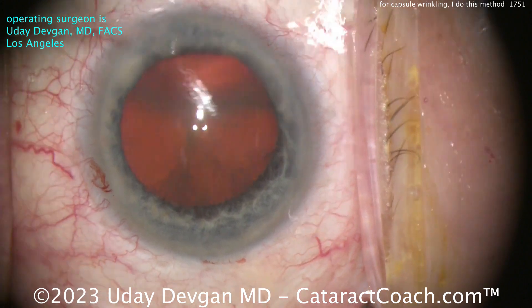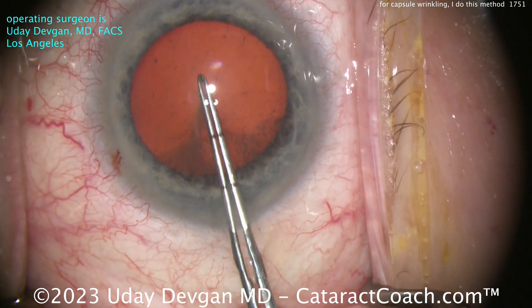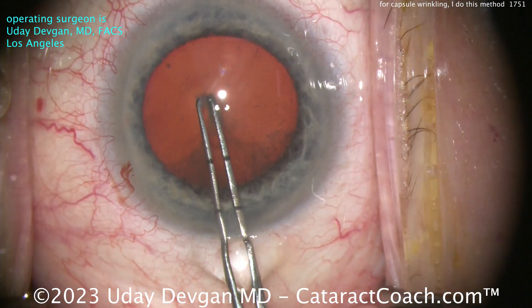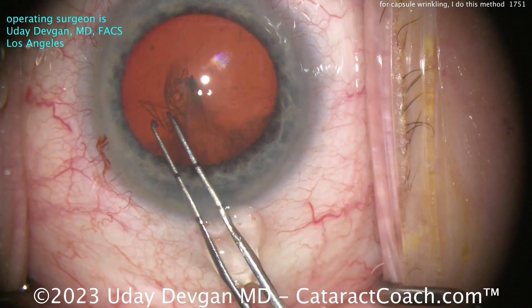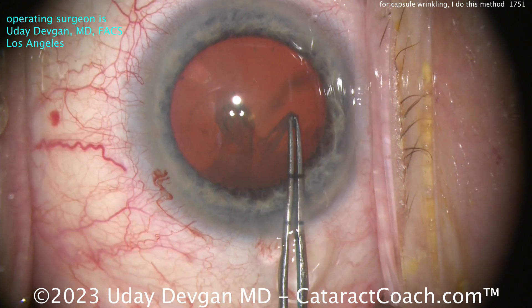Now let's get the rhexis done — here's where you're going to notice the issues. Watch this. Normally I poke in with the forceps, measure that out and poke it. And look at the wrinkling — look at all that wrinkling. That tells me there's global zonular laxity. Not terrible, but all over, just a bit lax on the zonular support.